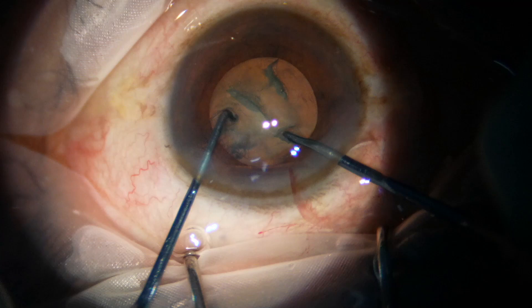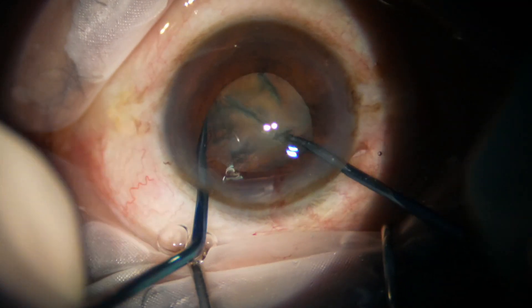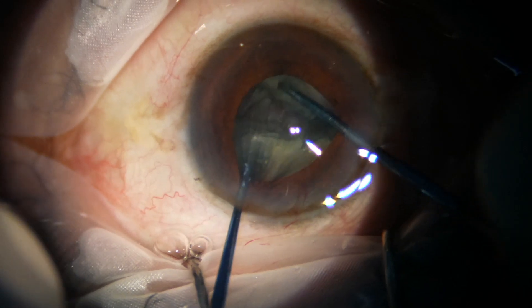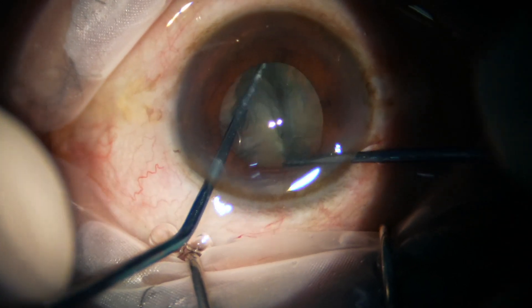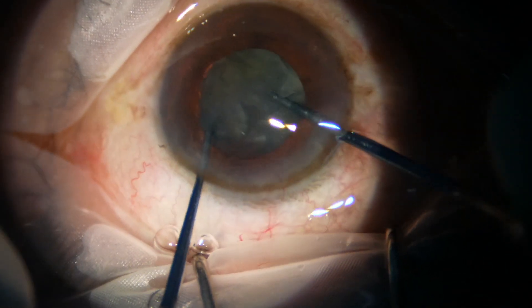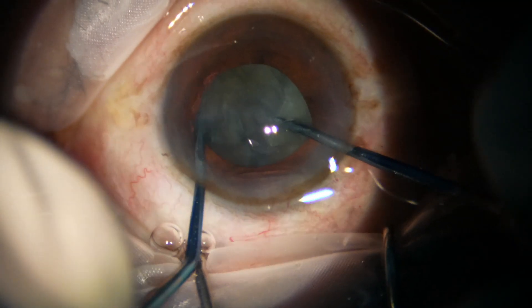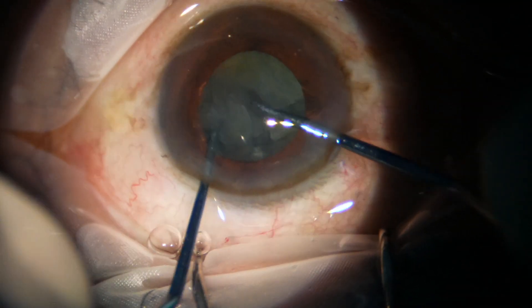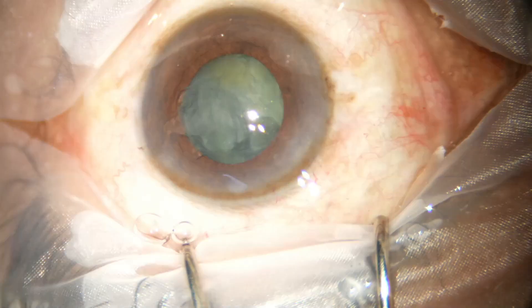And now I am using this instrument — this is Mohanta's pre-chopper and sustainer. I rotate the nucleus with the sustainer and the pre-chopper and divide the nucleus into three pieces.